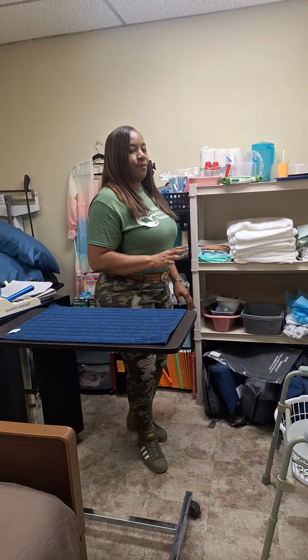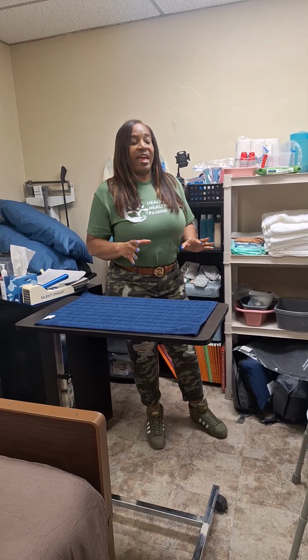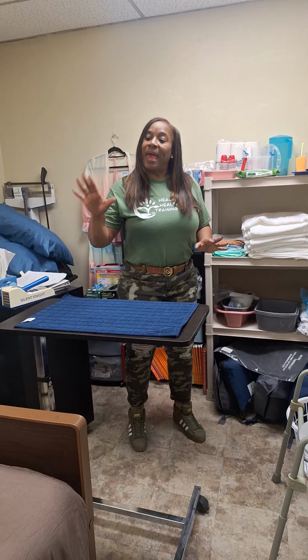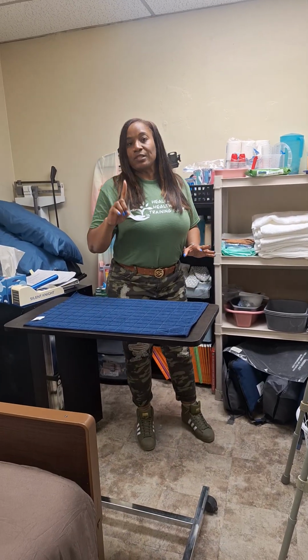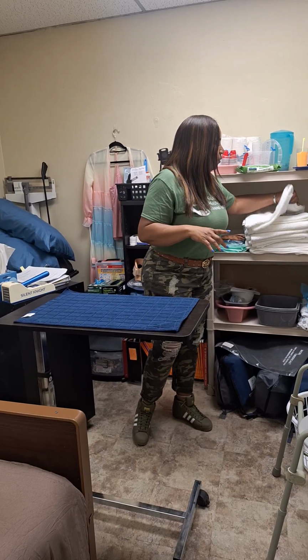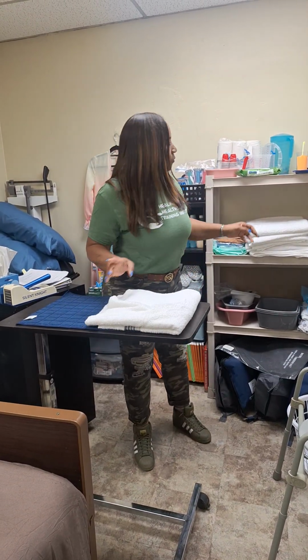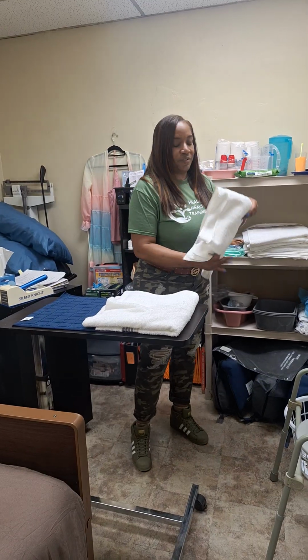So what do we need for catheter care? The proctor is going to read you a scenario, and you do not have to put a pad up under the patient. So that's one thing you don't have to get. You need a cover-up blanket for the patient. So you're going to need a bath blanket to cover the patient up, and a dry towel to dry off the catheter.